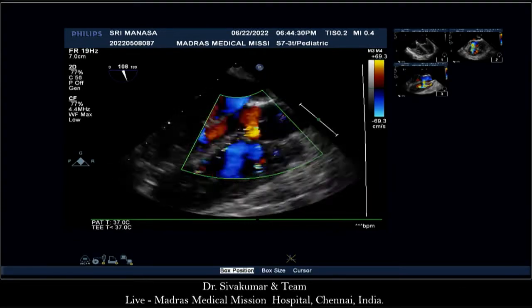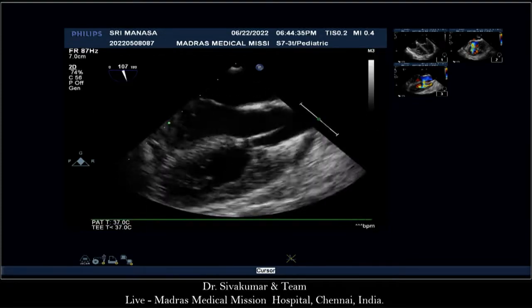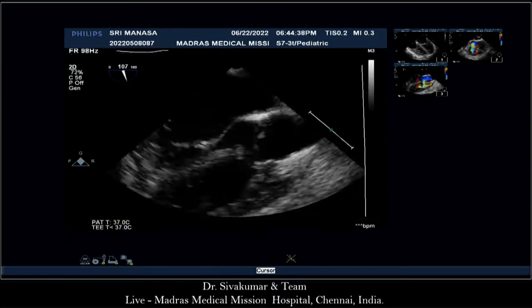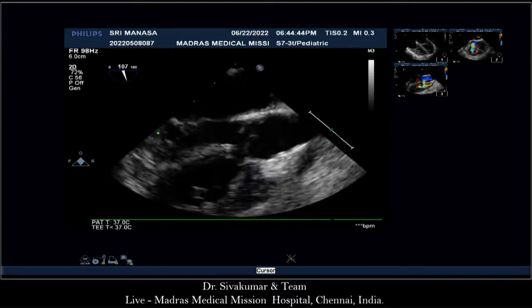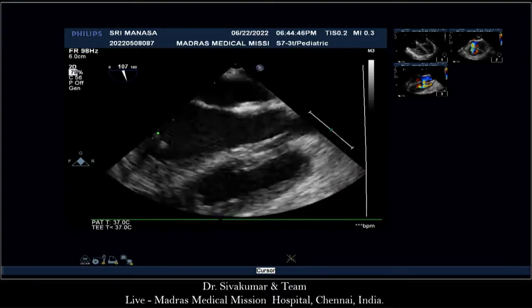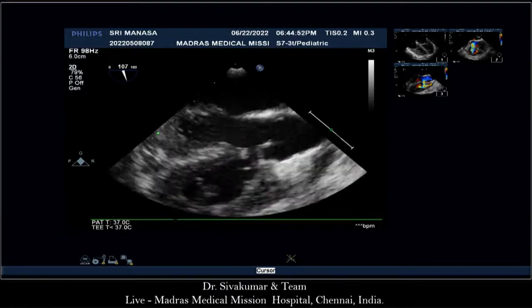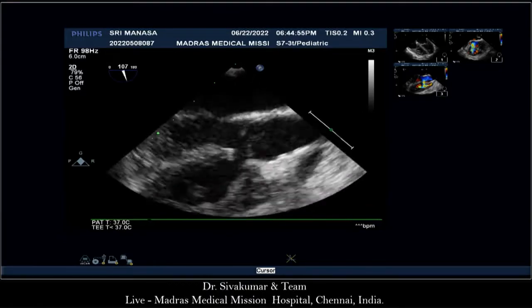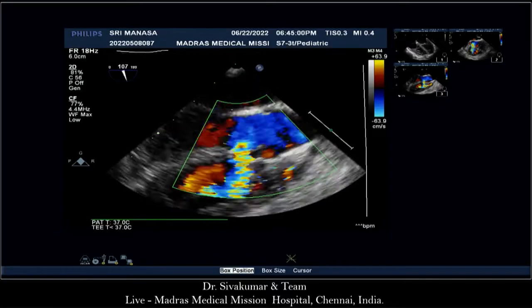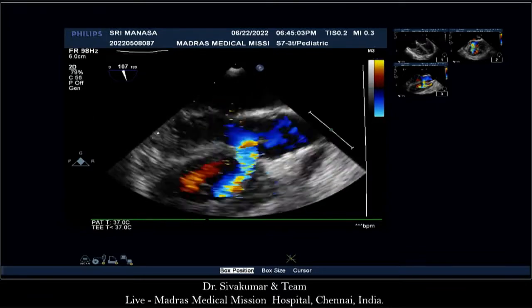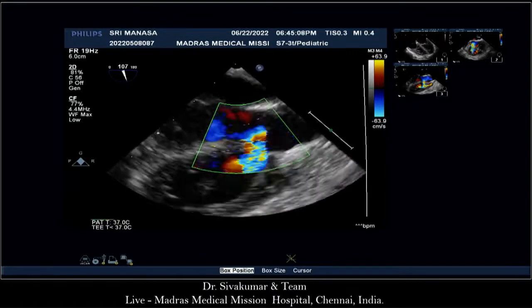There is a slight elongation of the right coronary cusp. In many centers this would not be attempted because of no support underneath the right coronary cusp — no rim. There is no significant aortic regurgitation on echo, zero regurgitation. However, there is no rim between the defect and the aortic cusp, raising risk of developing aortic regurgitation.